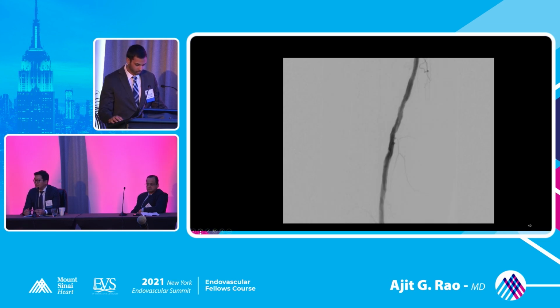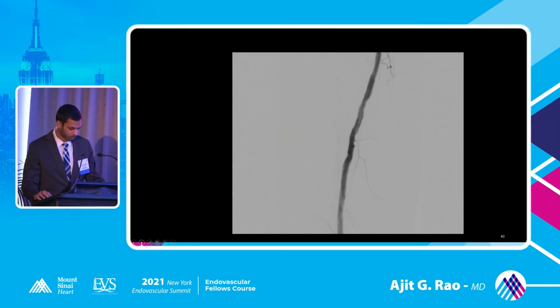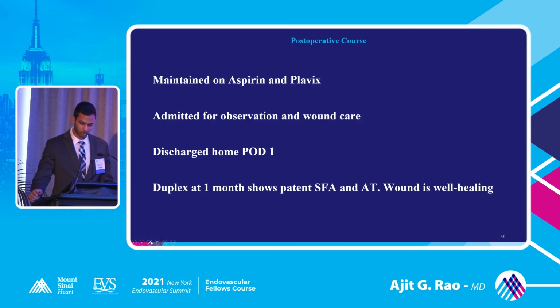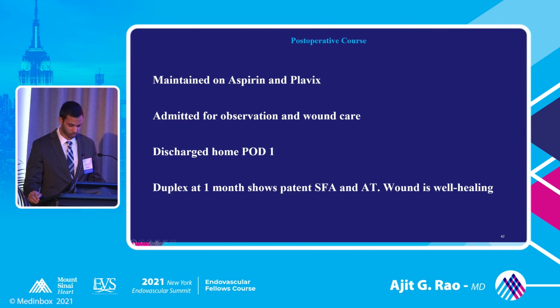So here are some images for the completion. Pretty good result with this. And you can also see the anterior tibial actually fills faster than the other vessels now. So this patient did pretty well. I maintained him on aspirin and Plavix. He was admitted just for observation and wound care, and he was discharged home. His duplex at 1 month shows that both vessels are patent and the wound is well healing.